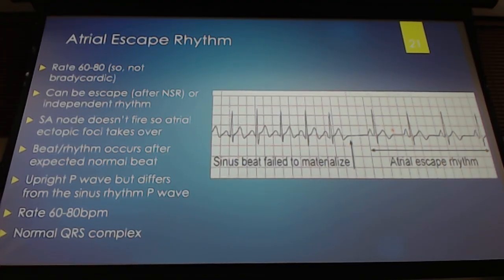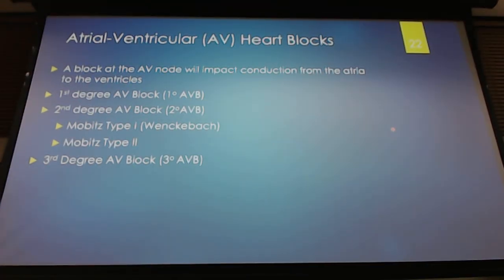So that's not something that you'll see. Is this an atrial escape, or is this an atrial rhythm, or is this coming from the SA node? It's not something I would expect you to know. So we don't have an ECG for that on purpose, because we typically are not going to be able to identify that. Sometimes the ECG machine can identify it, and it'll tell you at the top that this is atrial escape, and they're doing that by virtue of how it's looking at the P wave, and how that's being projected onto the ECG paper.